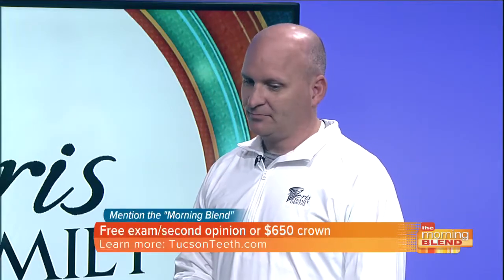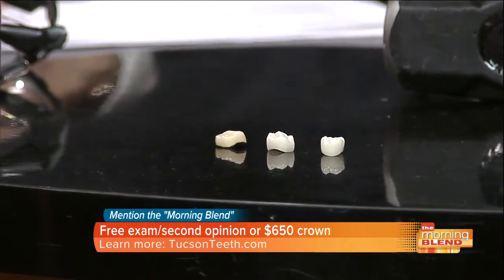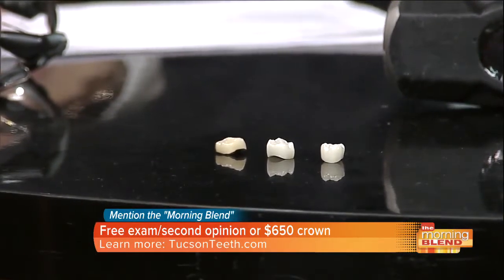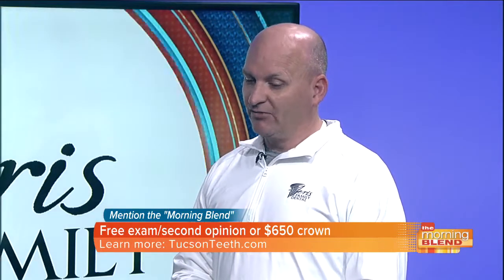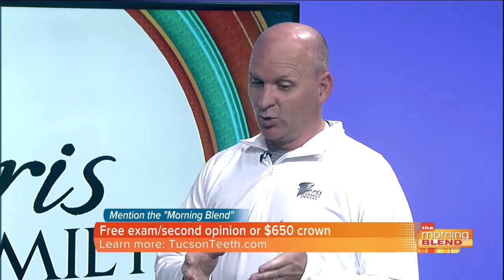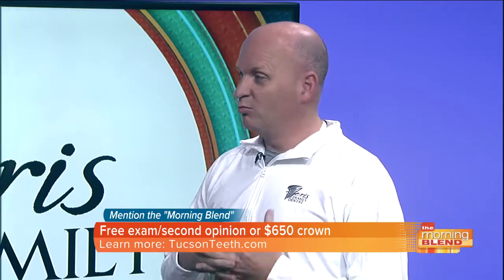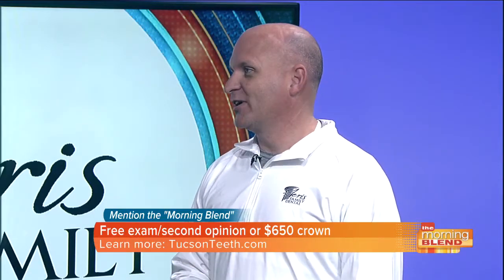Now, do you mill these in your office, or is there a lab that does these specifically? We do them in the laboratory, because that's where the strength and the focus of manufacturing and materials can be really perfected. And so there are some that can be done in the office. We've chosen to have the laboratory do those, and maybe it'll demonstrate a little bit of why we do that.